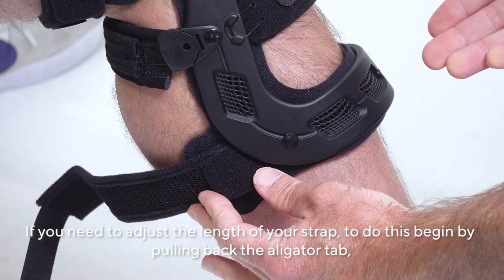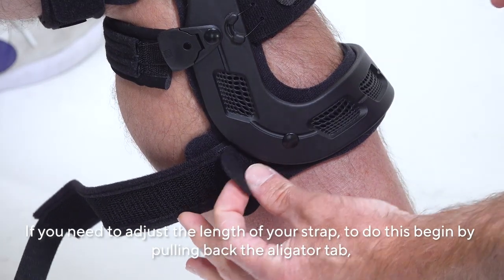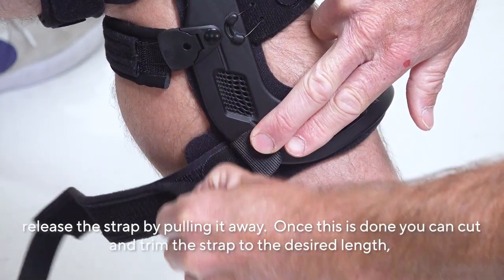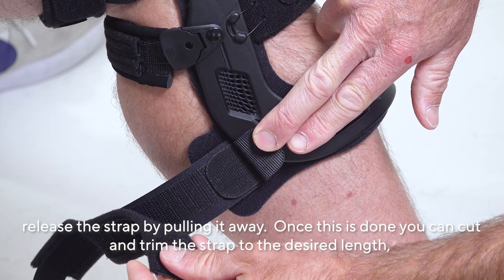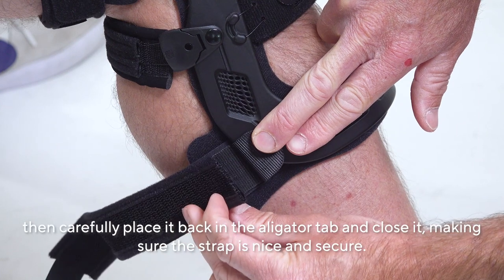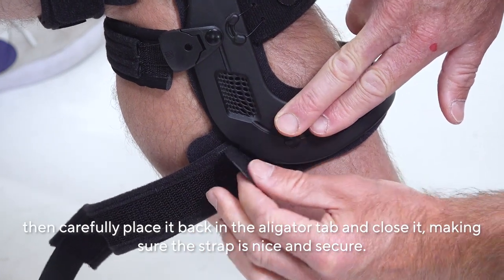If you need to adjust the length of your strap, begin by pulling back the alligator tab. Release the strap by pulling it away. Once this is done, you can cut and trim the strap to the desired length. Then carefully place it back in the alligator tab and close it, making sure the strap is nice and secure.